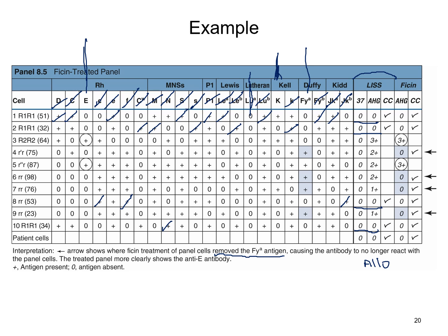Now if we look at our reactivity here, we've got some 3+ reactions, 2+ reactions, 1+ reactions. So we know that we've got either some dosage going on, we've got some mixed strength reactivity here, or we've got multiple antibodies. So what they chose to do here, because of that Duffy, and really thinking that that's probably what it is, just based off of the dosage that's demonstrated here, where you've got these 1+ reactions with your heterozygous and 2+ with your homozygous.